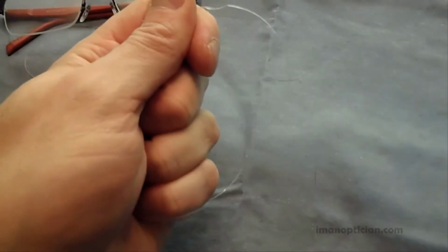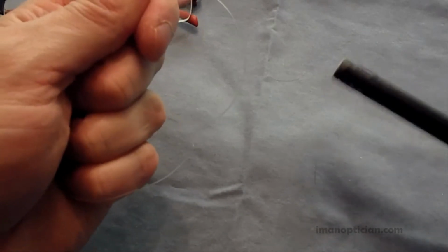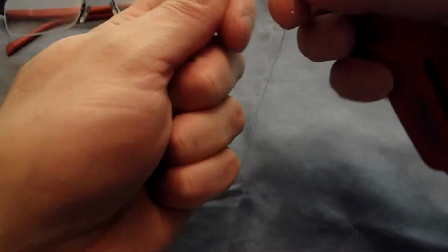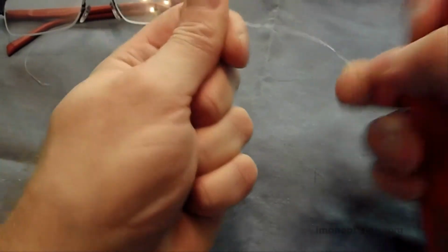Let's see if I can simulate that here so you can see. You can actually use a lighter. Now be careful with the lighter, because if it gets too close, it's going to shrink it too much, and it only takes a little bit of heat, and you can see how it shrinks right up. Again, you can shrink that quite a bit, and it'll be very tight.